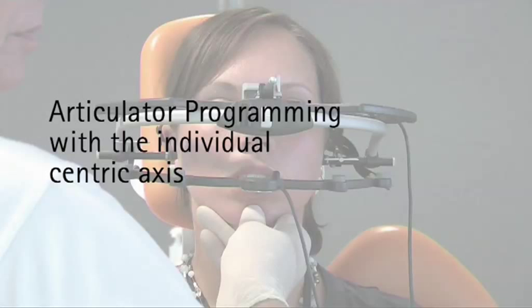Articulator programming with the individual centric axis. If the operator requires model installation and articulator programming with the individual centric axis, this is also possible.